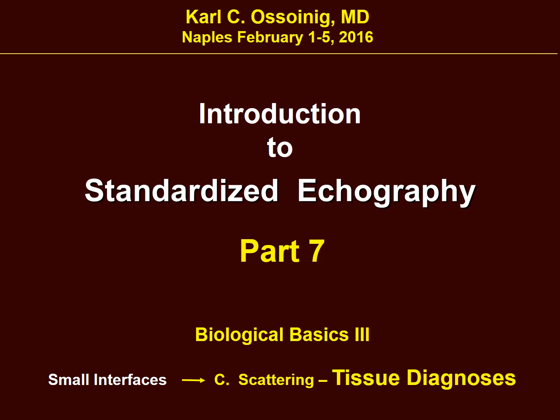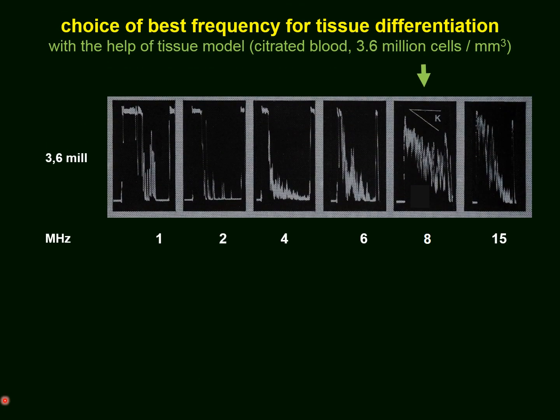In part 7 of the Introduction to Standardized Echography, we will discuss the role of small acoustic interfaces, scattering at these interfaces, and most important, tissue differential diagnosis. At first it was a question which frequency to use for the standardized scan in the differentiation of tissues.